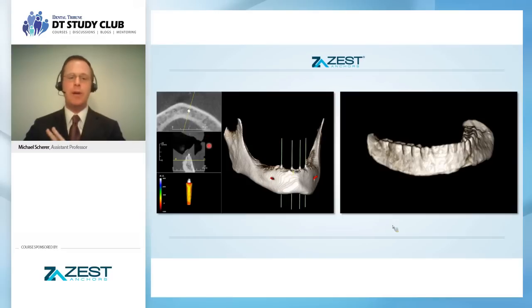It makes treatment planning so easy and so effective, because if you create this airspace around a complete denture, that's going to allow you to see the outline of the denture, giving you a very good estimate of how much prosthetic space you have and the angulation that you're going to be placing upon the implant. This is a topic that we'll cover at a later date in subsequent sessions.